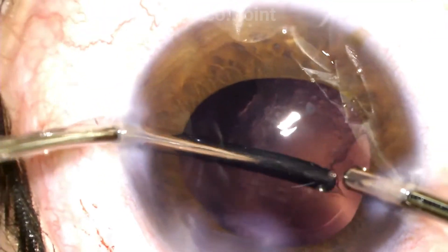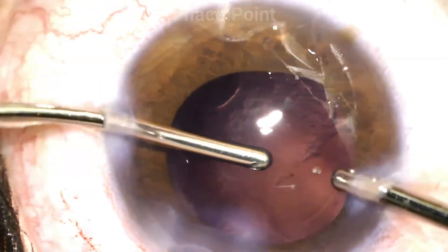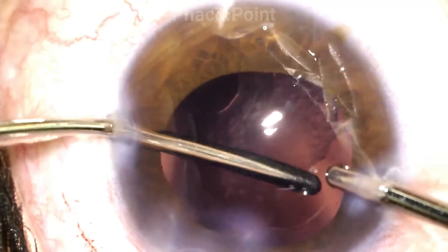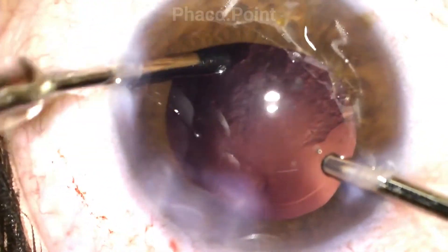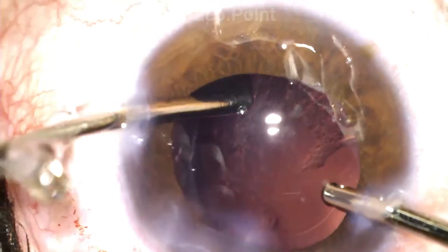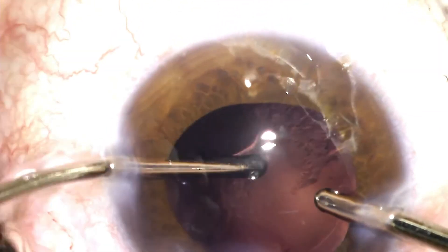Now how does this really work? The irrigation cannula stays within the anterior chamber with the irrigation ports constantly facing the angle. The irrigation cannula also works like a lever that pulls on the eye in different directions to aid the ease of removal of the posterior capsular cells.